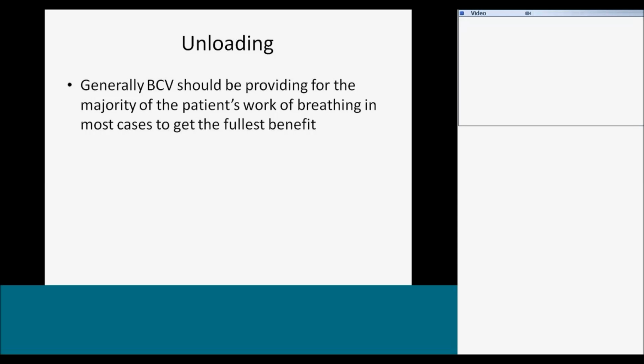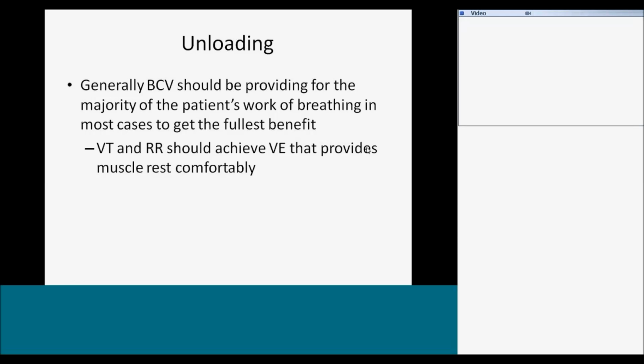So our most typical way of applying this is so that it picks up the patient's entire work of breathing, and that's what we want to see happen in order for them to get the fullest benefit from the device.